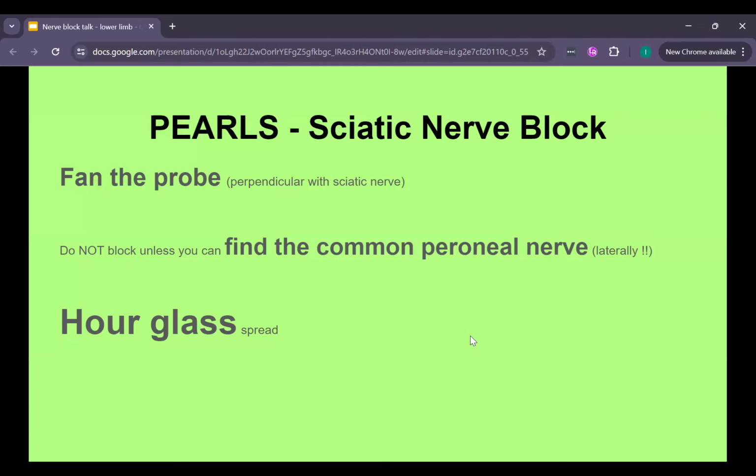The other thing to keep in mind is that if you're using this block in combination with a saphenous nerve block for a foot procedure, a popliteal sciatic nerve approach may not cover the tourniquet if it's placed on the thigh. So that's another thing to keep in mind. Ways you can get around that are either just checking in with the patient and providing reassurance, or it may need a little bit of sedation just to help the tourniquet discomfort if the surgeons aren't able to put the tourniquet on the calf.